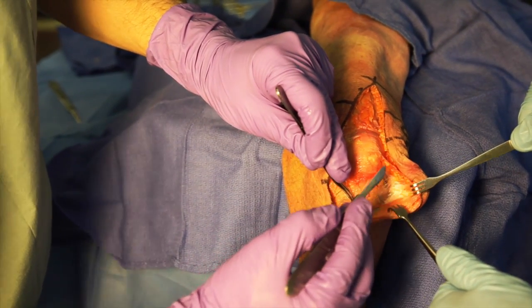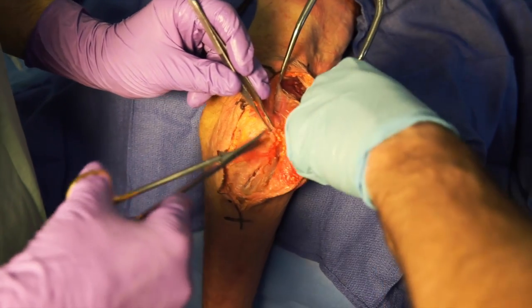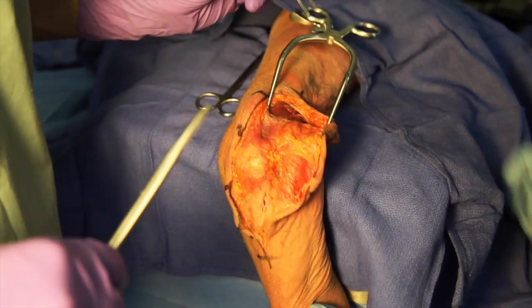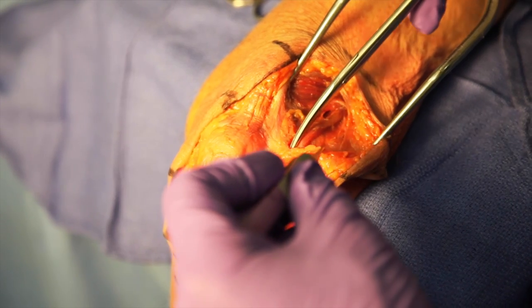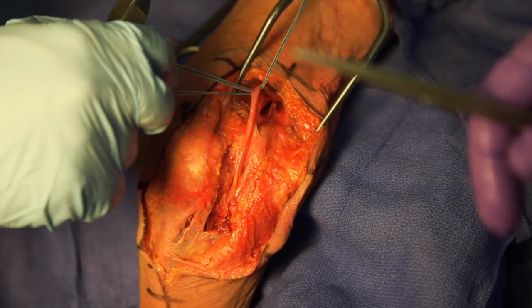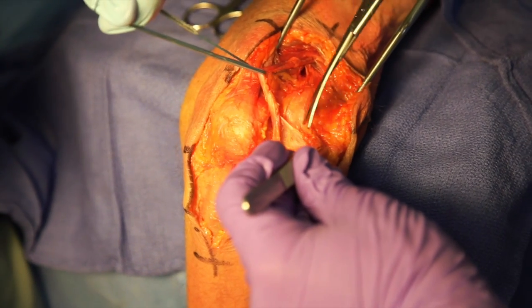A full thickness flap is raised medially to expose the ulnar nerve. A Gelpi retractor is placed medial to the triceps muscle to locate the ulnar nerve posterior to the intermuscular septum. The ulnar nerve is dissected proximally to the arcade of Struthers and distally to the first motor branch to the FCU. A vessel loop is placed around the ulnar nerve to aid with decompression.